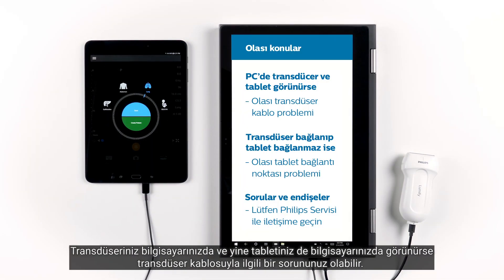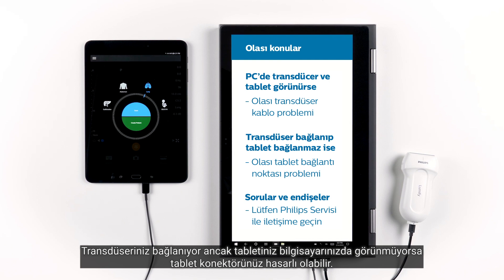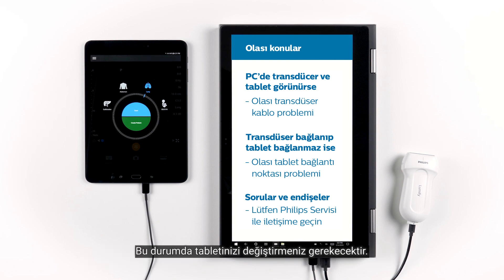These two tests together can help you pinpoint the issue. If your transducer shows up on your computer and your tablet shows up on your computer, then you may have a transducer cable problem — just call your Philips service representative to get a new transducer cable. If the transducer connects but your tablet does not show up on your computer, then your tablet connector may be damaged, and you will need to replace your tablet.